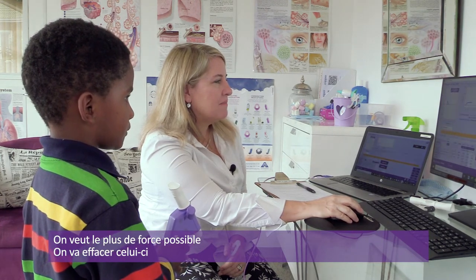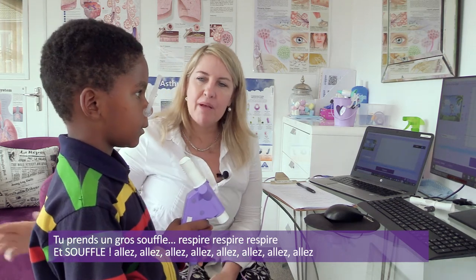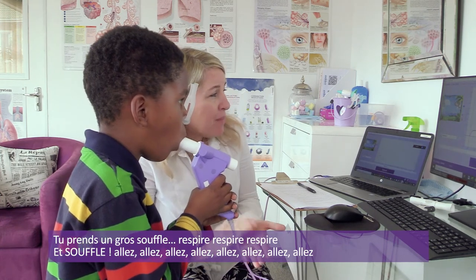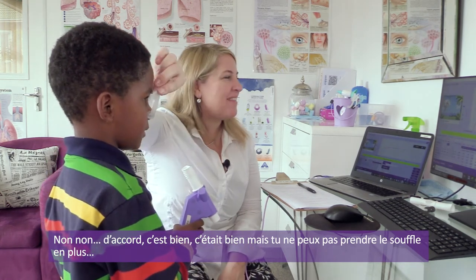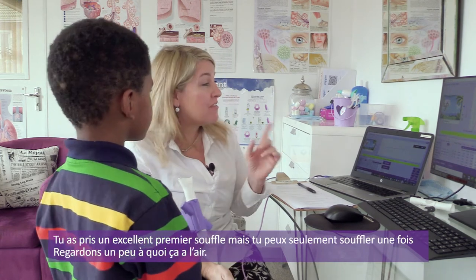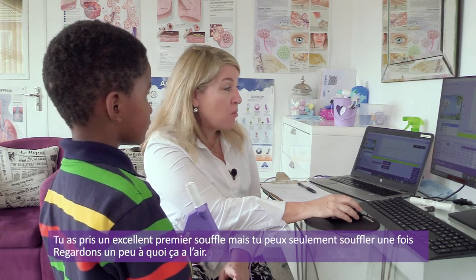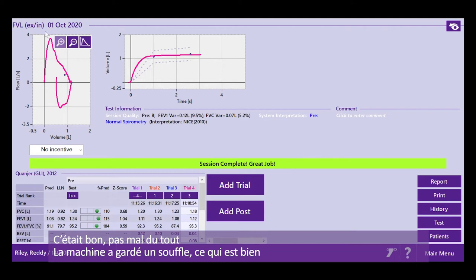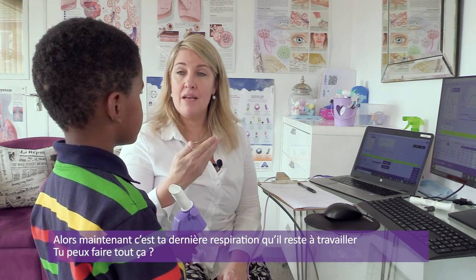Let's cancel that one. Okay, just rest a moment. Okay, are you ready? Okay, big one, big. Oh, no. Okay, well done. Okay, you did one, but the thing is you can't do the extra breath. Okay, so you did very, very well on your first breath there. But you can only blow once. All right, let's see what that looks like. Okay, that was pretty good. Okay, it only kept the one blow, so that's a good thing. What we need you to do is make sure you breathe in at the end properly. Can you do that?